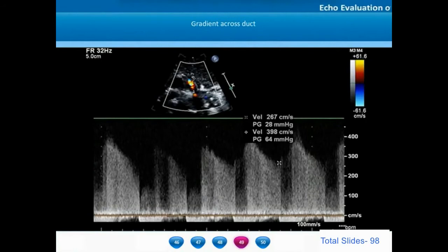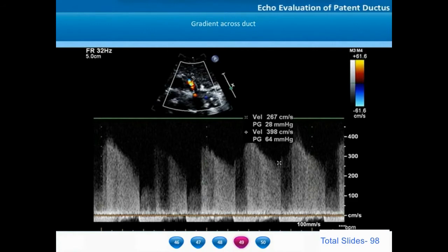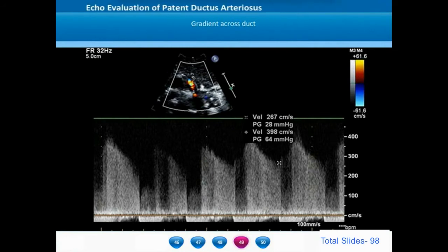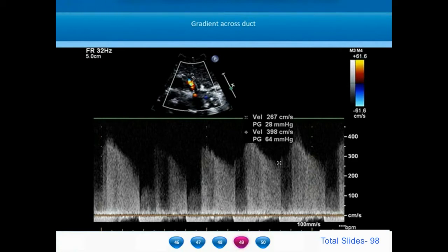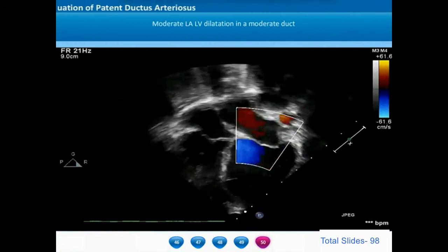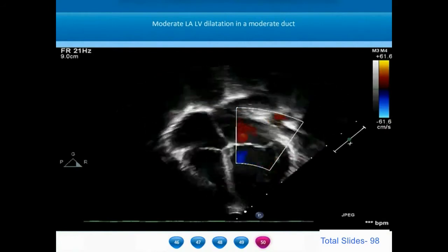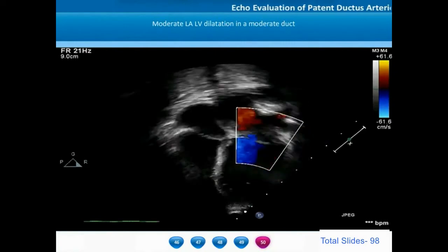When we take a Doppler gradient from the aorta to pulmonary artery with continuous-wave Doppler, the diastolic gradients are around 28 mmHg — an indicator of mild to moderate pulmonary arterial hypertension. If the aortic diastolic pressure is around 70 to 80 mmHg, the pulmonary artery diastolic pressure predicted by this gradient is in the range of 45 to 50 mmHg, indicating moderate pulmonary arterial hypertension. On the apical four-chamber view, there is more dilatation of the left atrium and left ventricle — the quantum of left-right shunt dictates the extent of LA and LV dilatation.